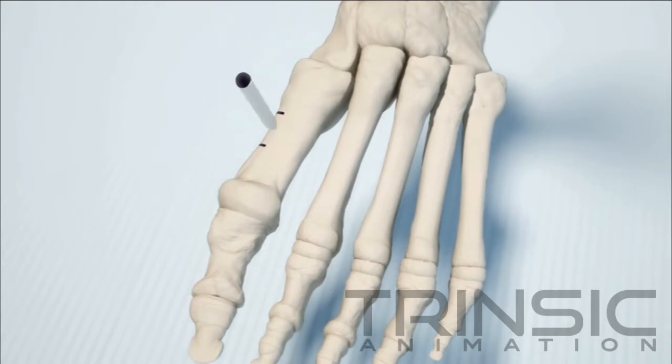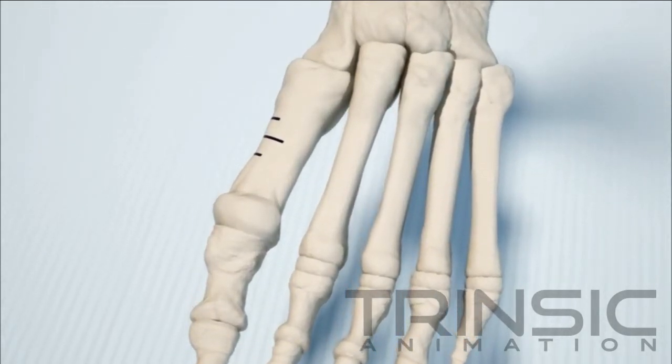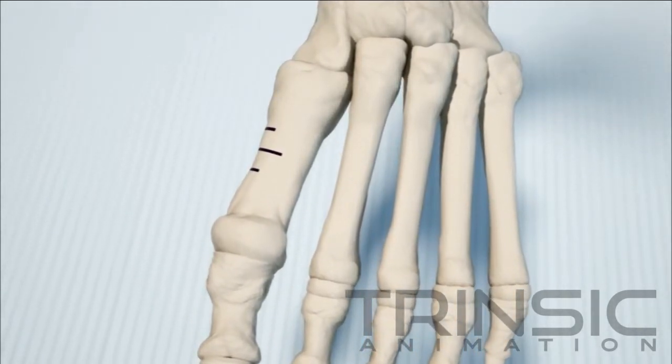Establish the location of the osteotomy. Make sure that the two distal pins avoid the metatarsal head, while the proximal pins can capture the second metatarsal or even the first cuneiform.